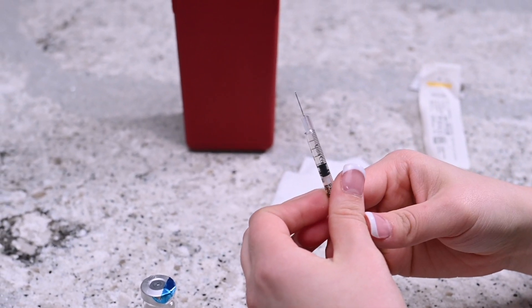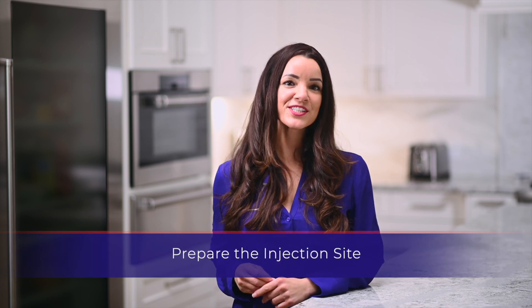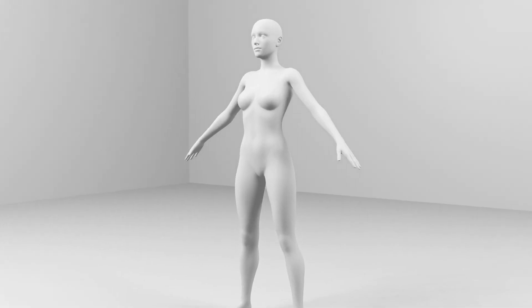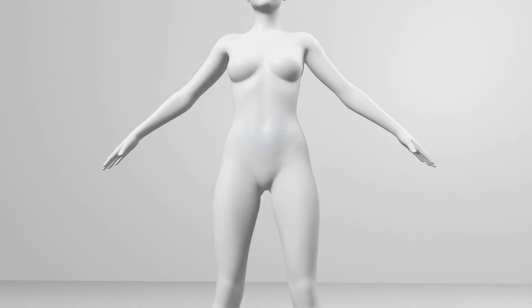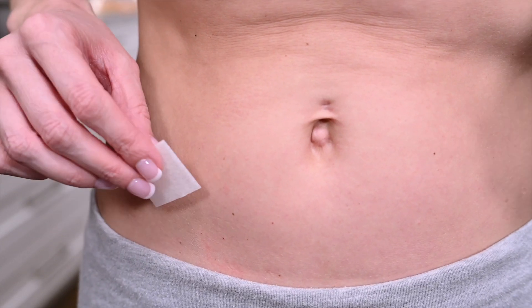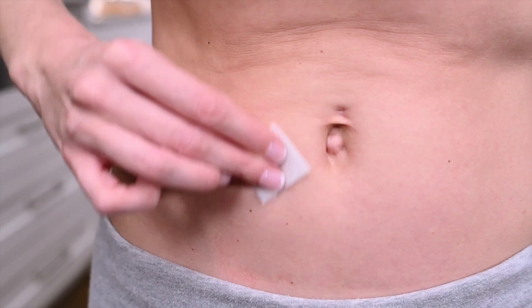The injection site will be a subcutaneous location specified by your physician. The most convenient site for a subcutaneous injection is in the abdomen around the navel. Use the alcohol prep wipe to clean the injection site and allow the patch of skin to dry. You may choose to alternate injection sites as needed.